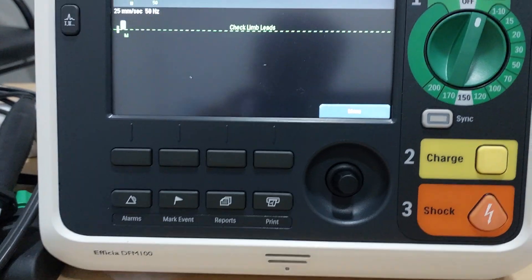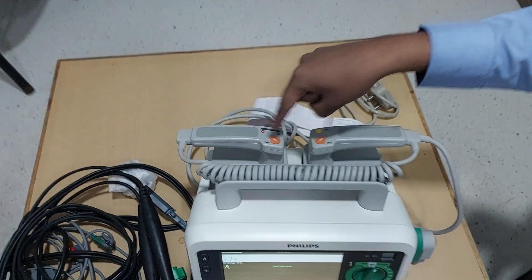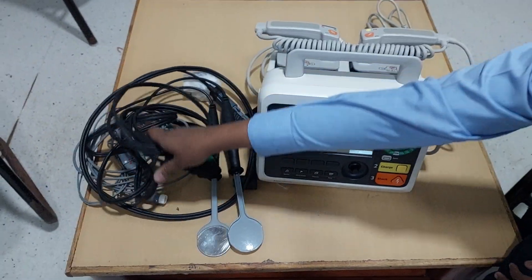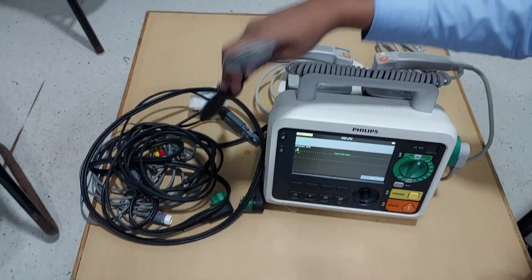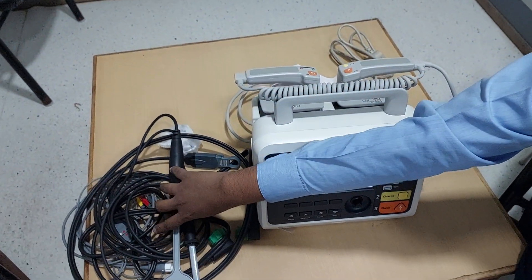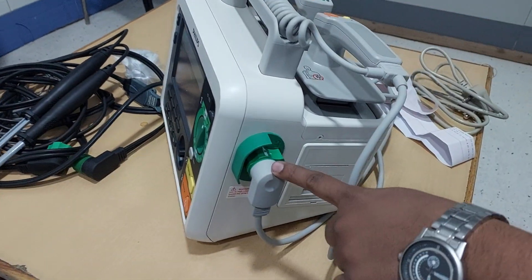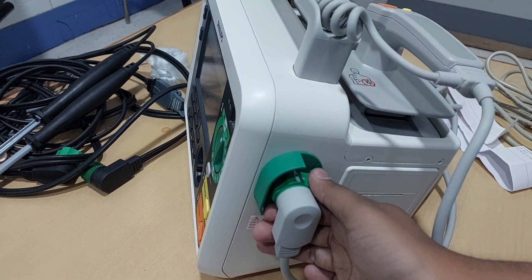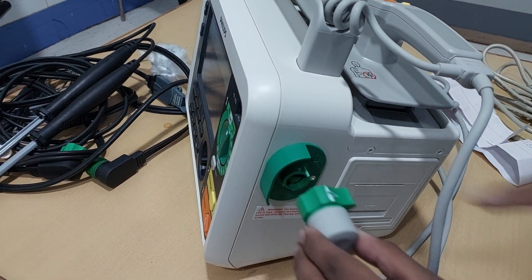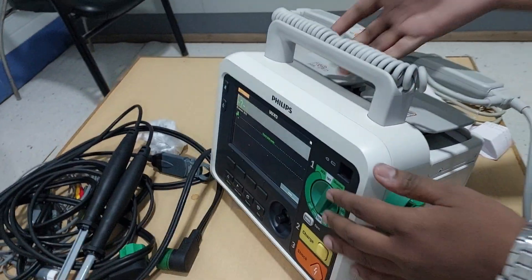Before it finishes booting, I will tell you two things. These are nothing but external paddles — you can see the external paddles of the machine. With this machine they have also provided internal paddles. During open heart surgery you can use those electrodes. How to disconnect and connect the paddles: you can see this knob — to remove the paddles you rotate it clockwise and just push it out. To fix it, you match the arrow and press it in — that means it is connected properly.